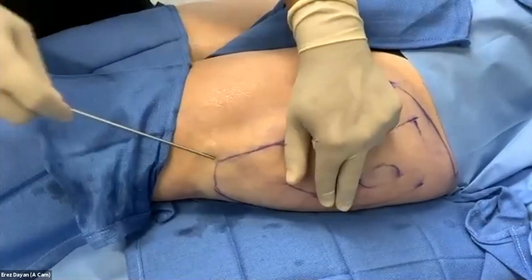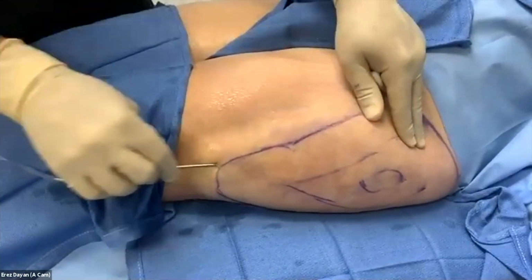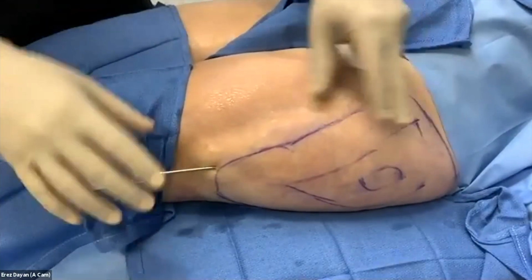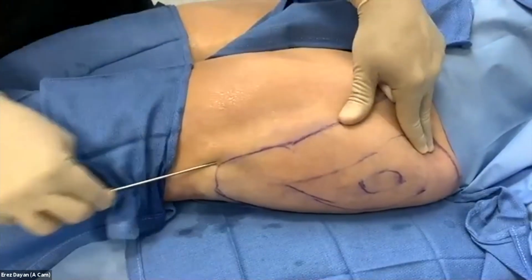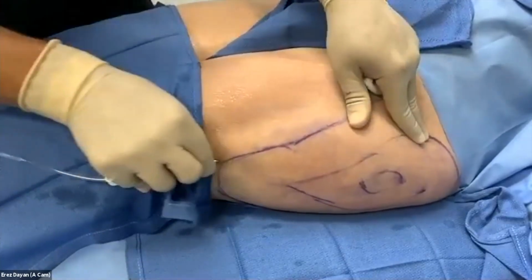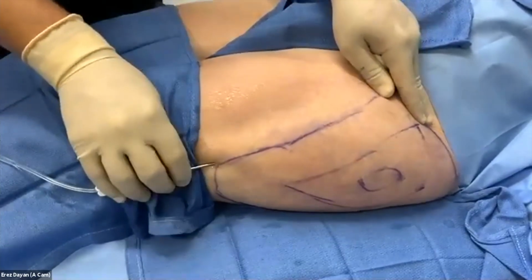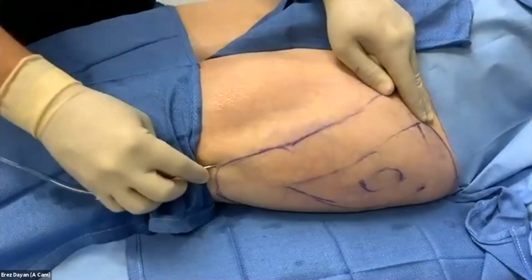But I like the tumescent because it allows me to make sure that I'm safe with the radio frequency. It acts as a heat sink, and then I know I'm in the right planes here. I don't want the patient to feel any pain, and then I have to come back and put more tumescent in. Same thing with the face. I'll probably put 200 in. Not in her case because we're going to do Accutite, but on a full face.